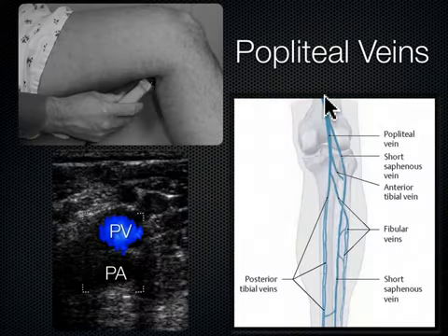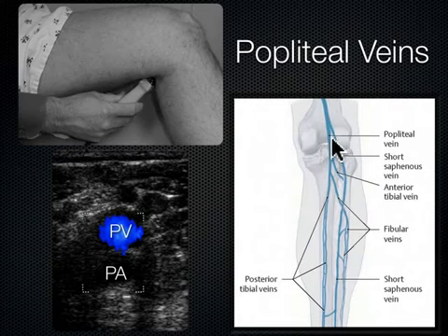And in that popliteal fossa, the popliteal vein comes down and then it bifurcates and trifurcates, and it's so furcated down here that it's such a small caliber in the calf that we don't really care about it too much anymore. Diagnostically speaking, those small caliber calf veins, even if they do have a clot, we don't treat them anymore. It does put them at risk for progression to a more proximal clot someday, so they do come back for repeat scans, but we're really concerned with this popliteal region.